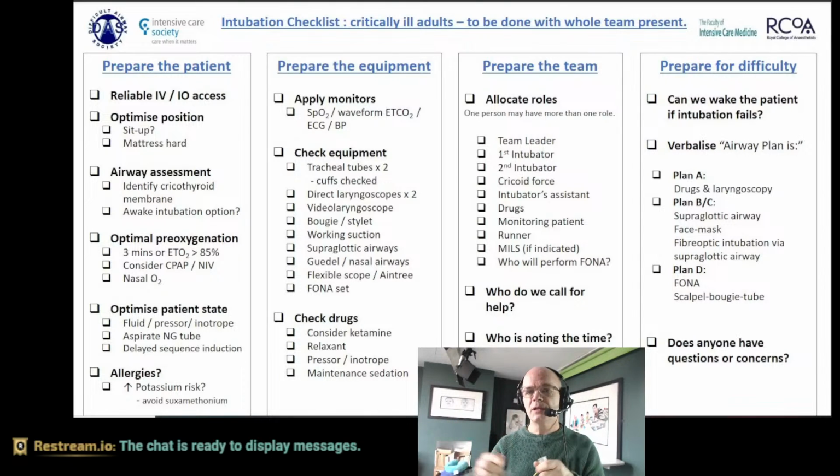When you see the CO2 returning, you know that you're actually managing to ventilate the patient, because you're getting the carbon dioxide gas out. But the key thing for this is that this is the gold standard as to whether you've actually intubated the patient's trachea or their esophagus. If you've intubated the esophagus, obviously you don't want to stay in there at all, because if you keep bagging that, you're just blowing at the stomach, and you're going to make that patient vomit fairly drastically sometimes.